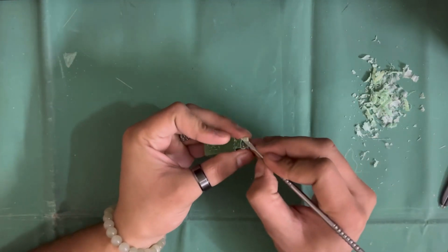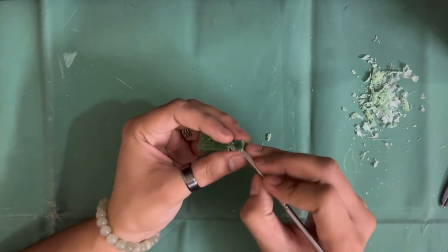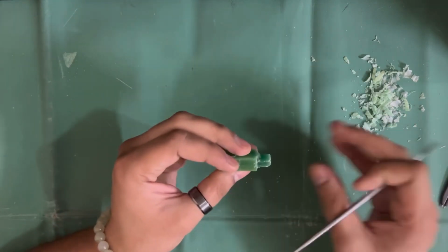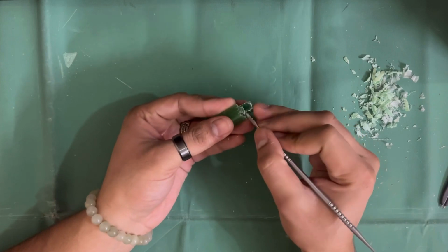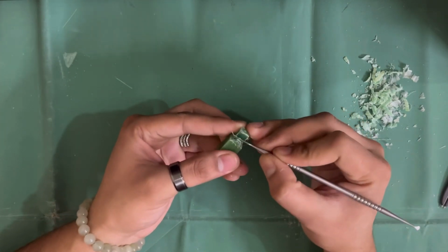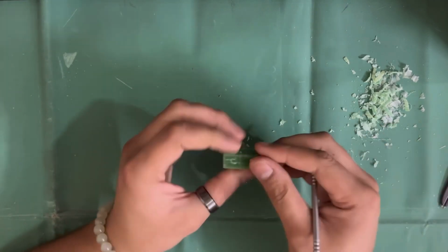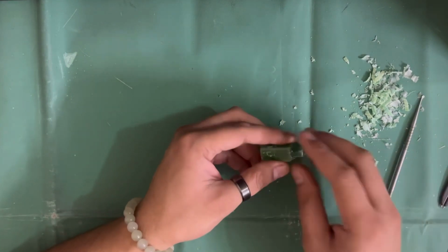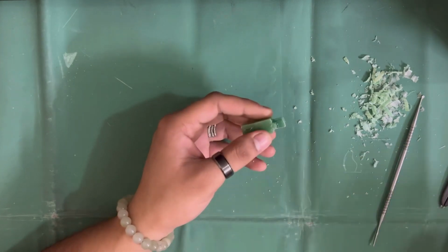Keep on checking the dimensions in between if you feel like you're not going correct. To be honest, carving from the sharp edge is not recommended, but yeah, it depends on your practice, how much you have practiced on the wax block. You can use it this way, or you can use the blunt end, the way we did in the triangle carving, we can carve the surface that way as well.